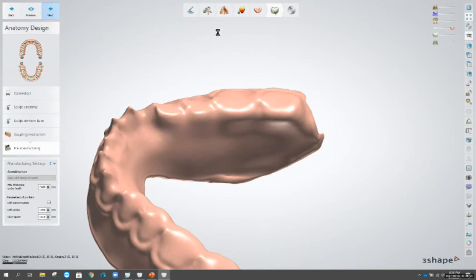Brandon, there's a question about the design software, but specific to crowns, and that is confirming if you're able to adjust the thickness of crowns, like you can adjust the thickness of the denture. Yes. Yeah. So our Crown and Bridge software will give you a default minimum thickness based on whatever the material is set for, but you can adjust that. So if you need to make it thinner, you can do that. You just have to make sure that you know that that could affect the longevity of that restoration.